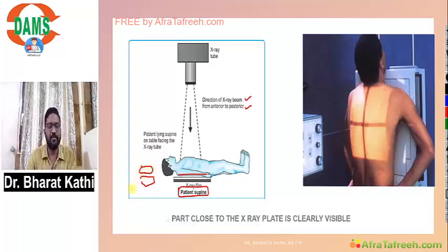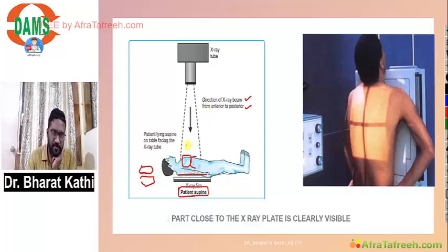So once the scapulas are very close, they will occupy a lot of space on the chest X-ray. And moreover, whenever you lie down, your diaphragm will slightly come up. Because of that, your heart in that space will appear a little bit bigger. Because you are lying down, the ribs are not expanding properly. They will have more of a horizontal contour.